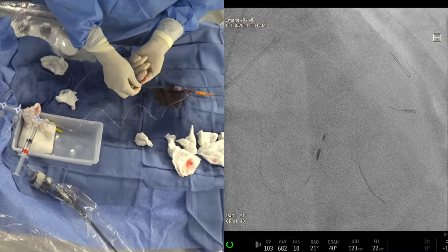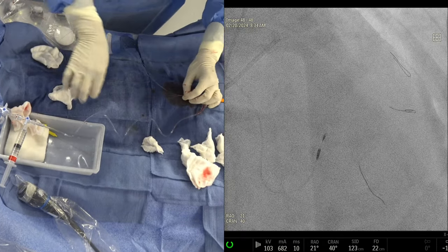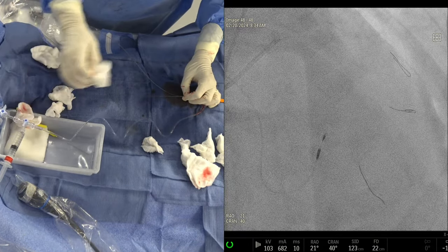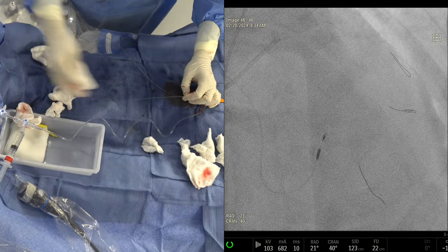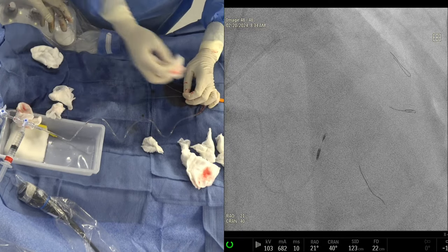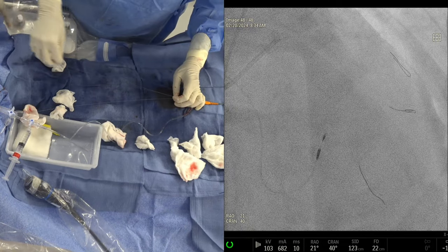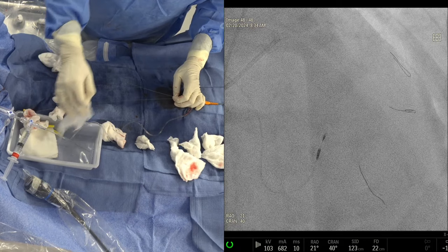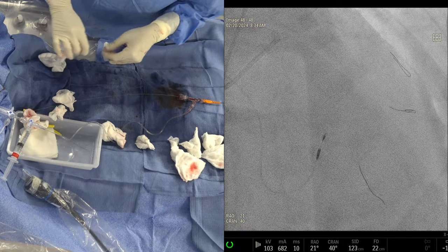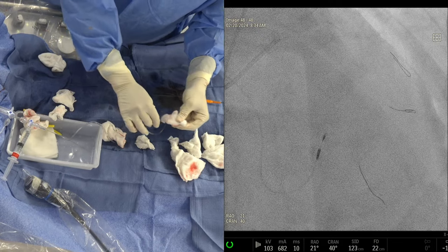Although right now it is done on a protocol basis, there are a few programs like Cleerly, and HeartFlow is having it too. So they will give you prediction beyond just FFR, whether the lesion we have seen is at high risk for a subsequent event. And that's what I'm going to show in a few of our slide presentations today. It's the lesion morphology, not necessarily the degree of stenosis. The lesion morphology is really important in many of these patients. Almost looks like we may be headed towards CT identifying a vulnerable plaque. Yeah, absolutely. Good. Do you want to take a picture, see where we are?